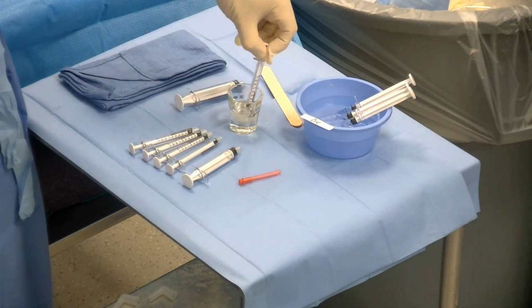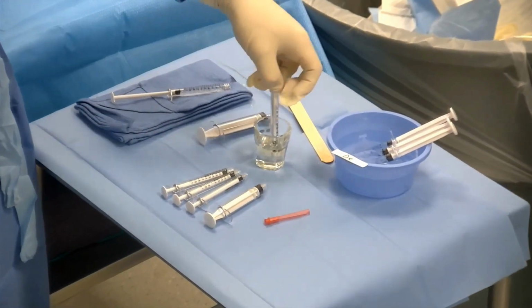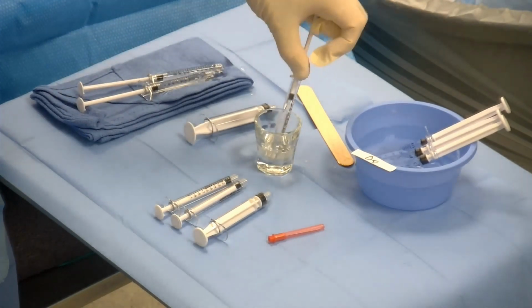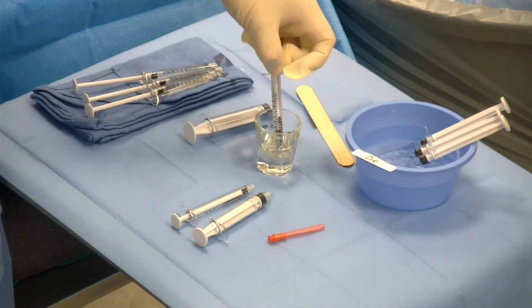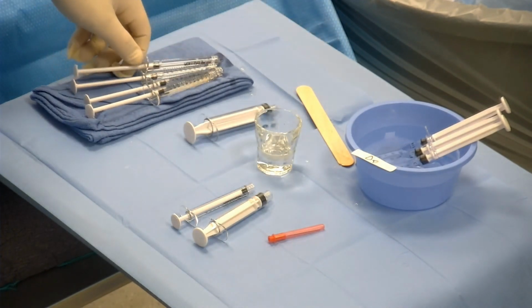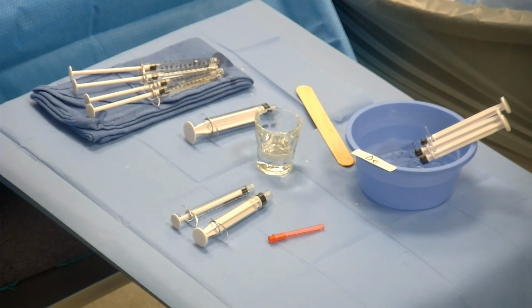I'm going to take 1 cc aliquots and lay them over here. I'm going to try to make sure that we keep this separate. We don't want to contaminate this with any blood or saline. I think this is probably enough to start with. We're not going to use all of this. And then in this bowl, we have our D5 water, which we're going to use as flushes.